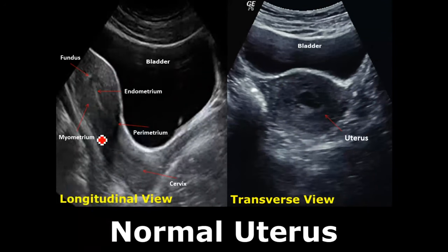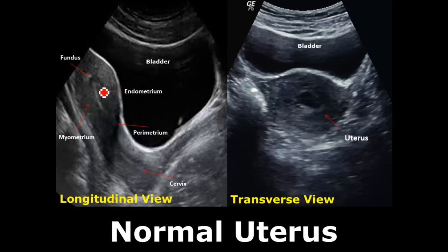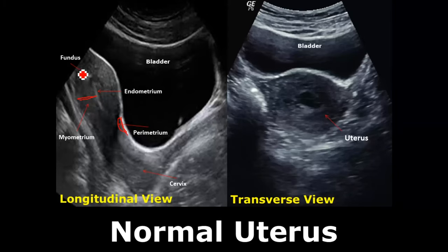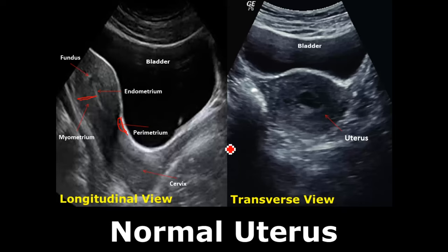In the longitudinal view we see the most detail. The three layers of the uterus are: the endometrium, which is the innermost layer; the myometrium, which is the thick muscular middle layer; and the perimetrium, which is the outermost layer. The top portion of the uterus is called the fundus, and the lower end where it meets the vagina is called the cervix.